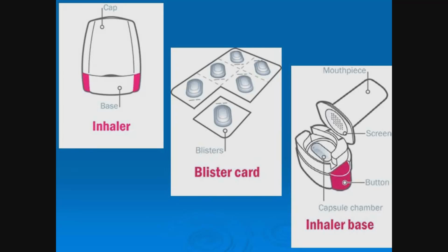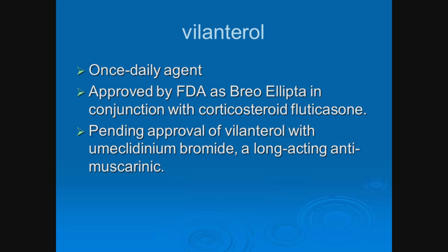And here's what the inhaler looks like, the little blister pack. You just drop the little pill, or a capsule, inside that chamber, close it, push the button, which crunches it, inhale it, and you're off and running with it.